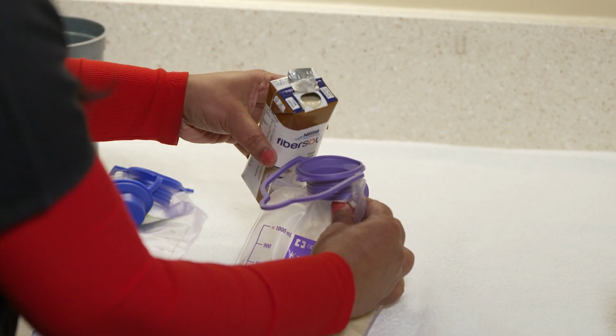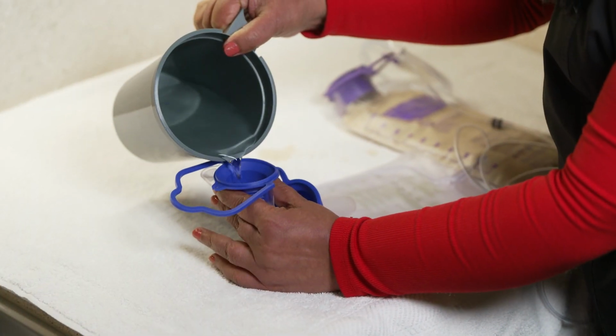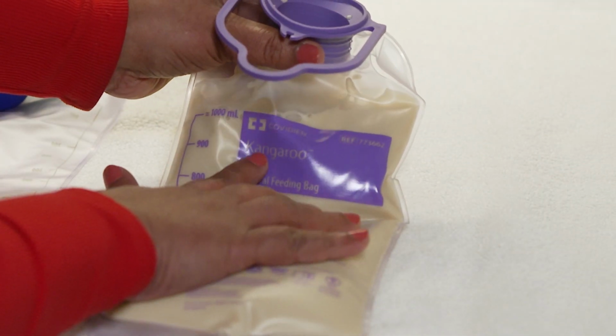Next, fill the feeding bag with formula as directed by your dietitian. Fill the water or flush bag with room temperature water. Remove any air from both bags.